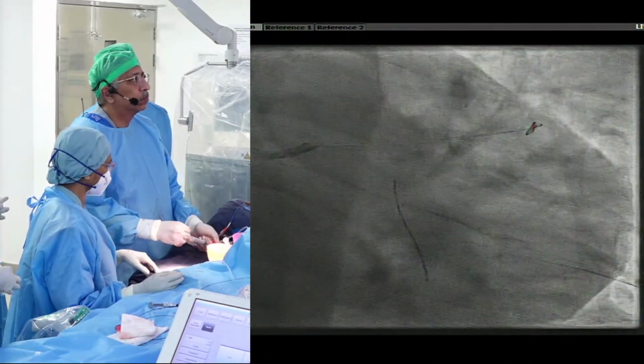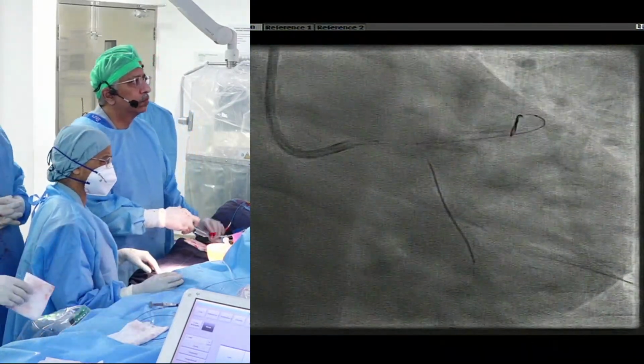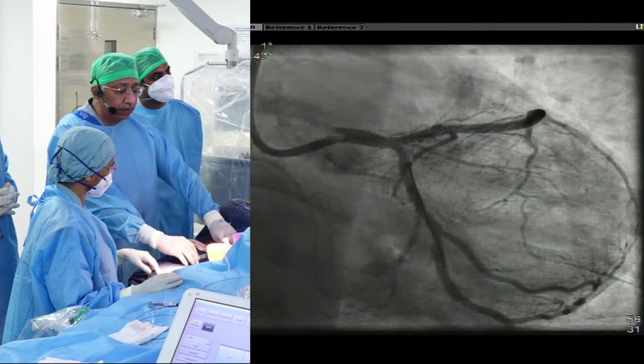I think OCT helps in selecting the type of treatment based on residual lumen area. Yeah, the carina is profiled, so we'll take it. So this is the conclusion of my talk, and I'm happy to take questions on this area. Thank you. Thank you so much.